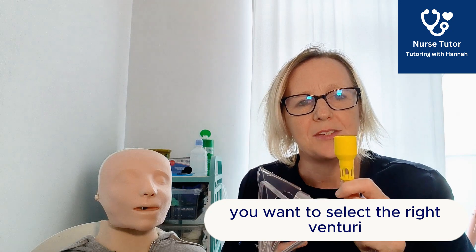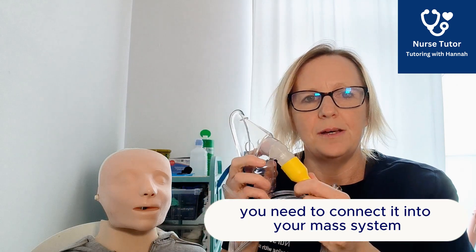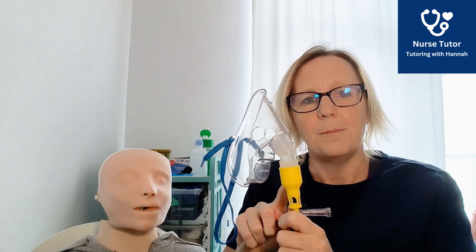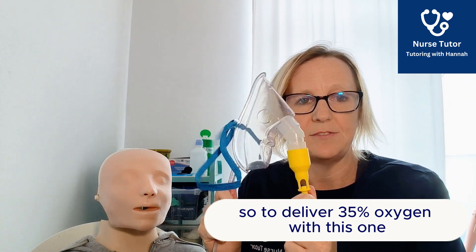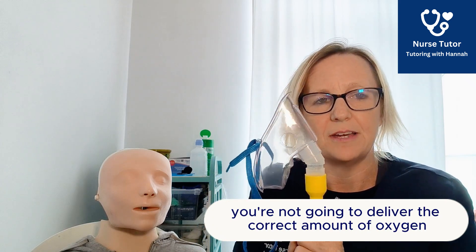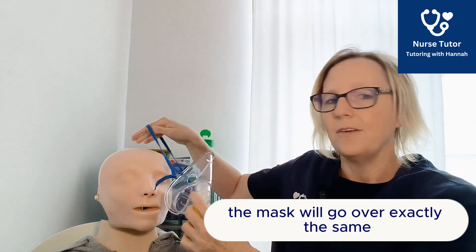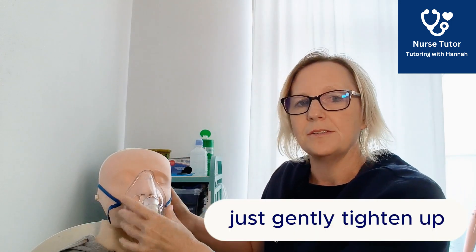Whatever your prescription is, select the right venturi — they come in different colours and percentages. Connect it into your mask system and connect your oxygen tubing. Connect this to your flow meter and set it to the dialled amount indicated on your venturi mask, which should also match your prescription. So to deliver 35% oxygen with this one, set it to 8 litres. It's important you set exactly what is written on your venturi mask, otherwise you won't deliver the correct amount of oxygen — and that's really important for these patients. The mask will go over exactly the same, making sure it's a good fit and gently tightened but not too tight.